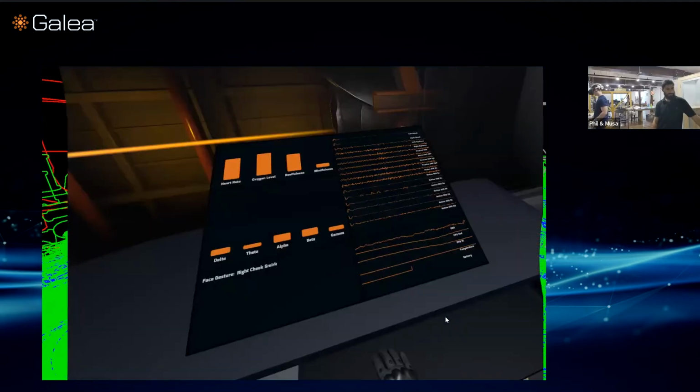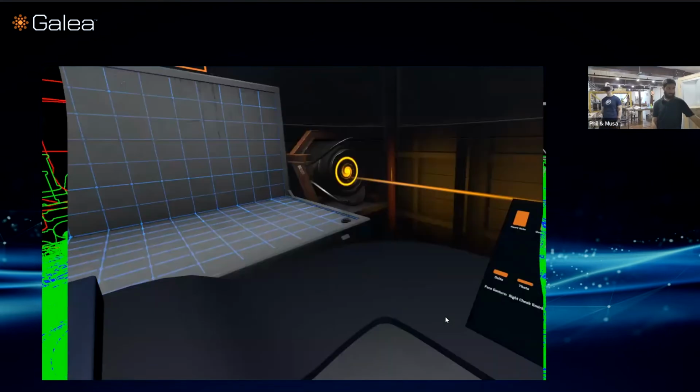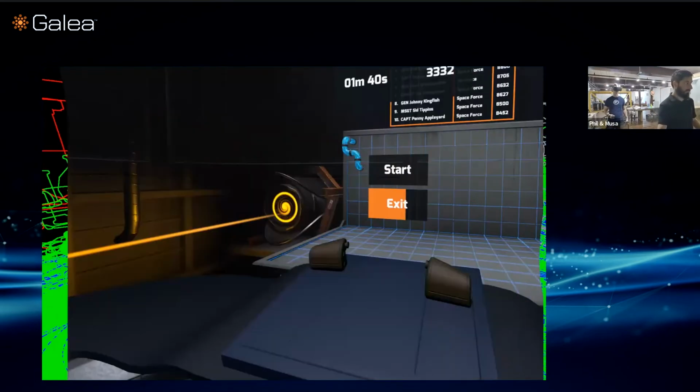Okay, cool. Let's do a totally fresh start here. Maybe we can do that oxygen saturation thing one more time. And while we get that set up, there is one question from the audience that's relevant. It's about the PPG. Do you only get heart rate or also heartbeat events from the PPG data we collect?